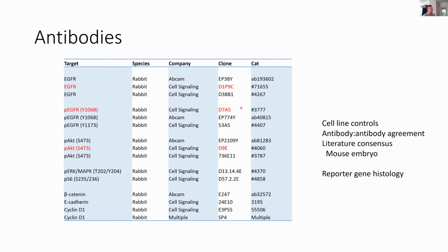And the other thing for phospho IHC, let me throw out there as a side note: does anyone know of the protocol in which you put phosphatase inhibitors in your 10% neutral buffered formalin in order to preserve phosphoproteins? There's an old protocol out there. We're still trying it, so I don't have any plus or minus experiments. You use it in Westerns for sure, right?